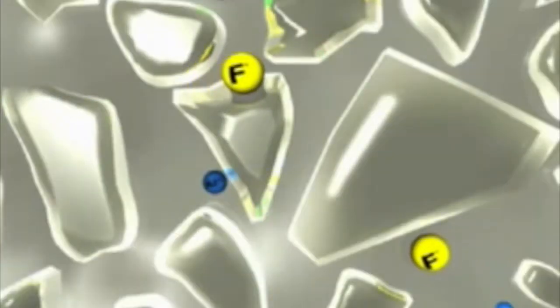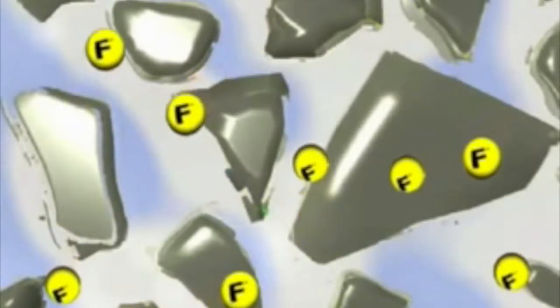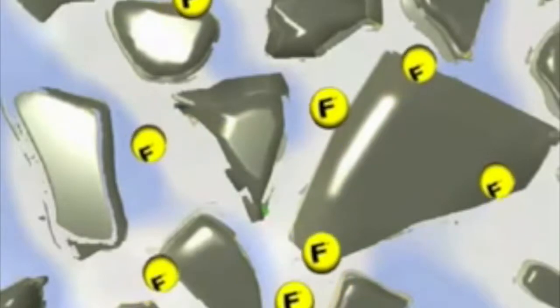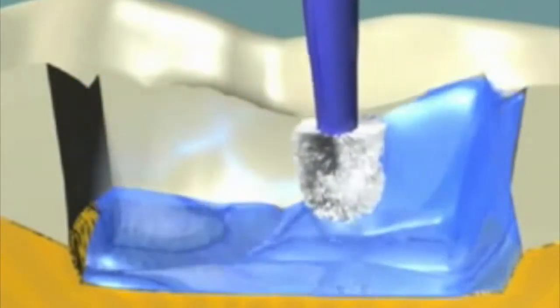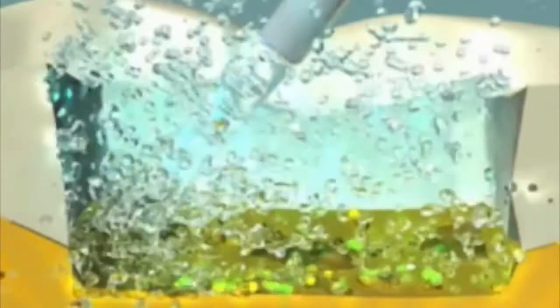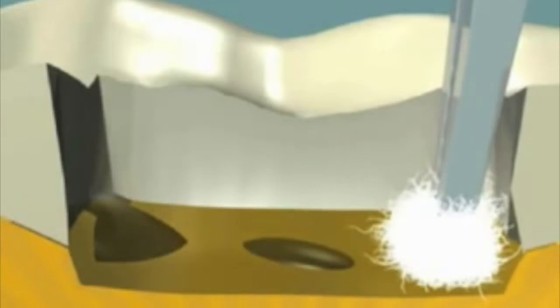Fluoride ions are also released during mixing. However, these form no part of the cement structure, and due to the remaining water in the glass ionomer cement, are mobile and free to move throughout the matrix. Prior to placement of the glass ionomer, it is helpful to prepare the cavity surface by applying a polyacrylic acid conditioner. After 10 seconds, the conditioner is washed off, removing the smear layer and surface debris. Excess water is then removed without over-drying the surface.